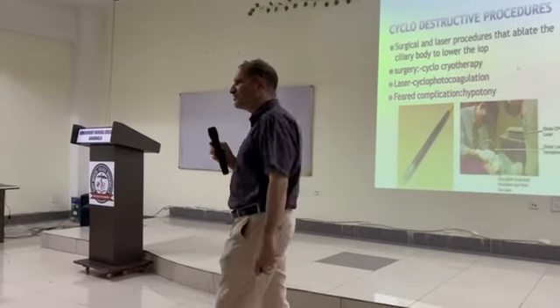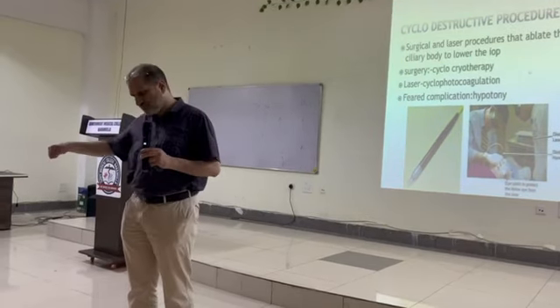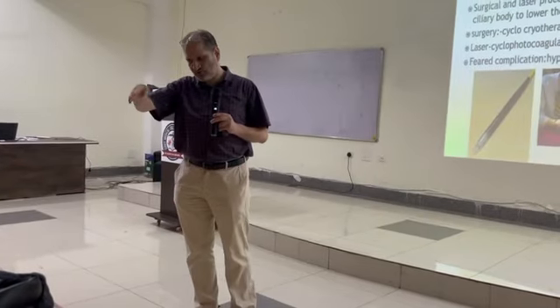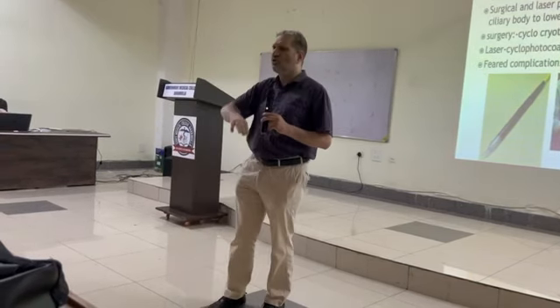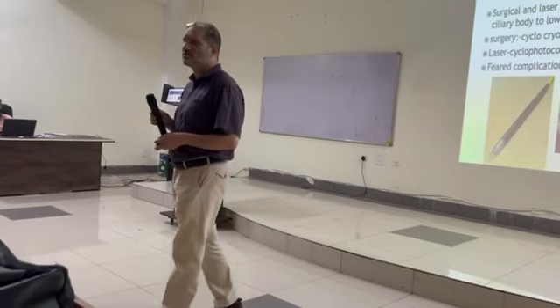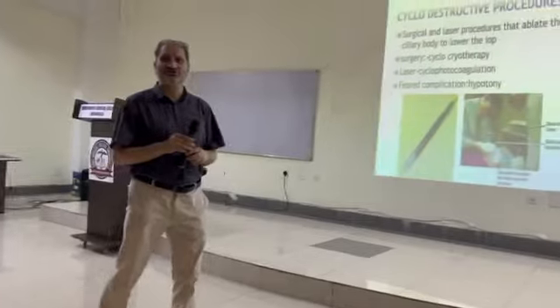Yes, internal trabeculotomy. You pass from one side, then make it 360 degrees, then once the two ends come here, you pull it for all 360 degrees. This is called internal trabeculotomy. So last we have cyclodestructive.